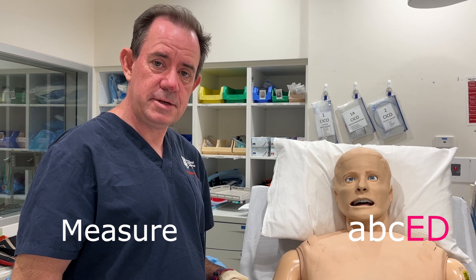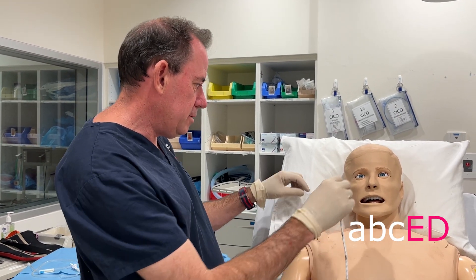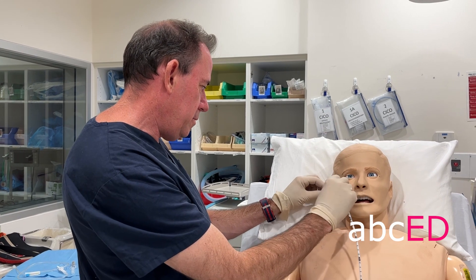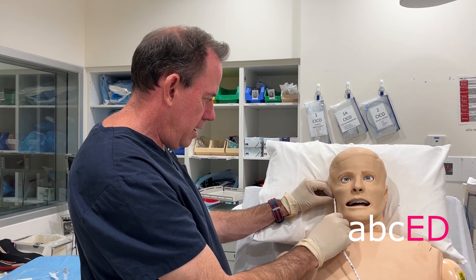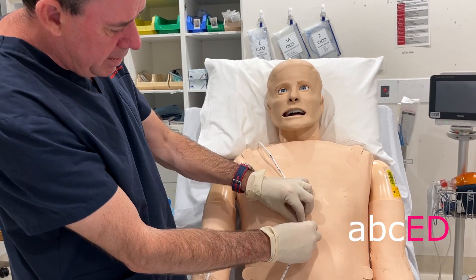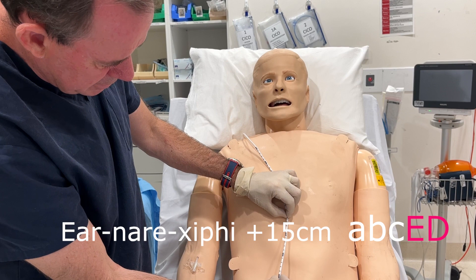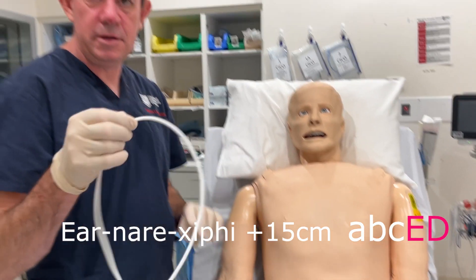What you want to do first is actually measure how far in the nasogastric tube is going to go. The best way is to measure from the earlobe to the nare, and then all the way down to the xiphisternum, and add 15 centimetres. In this person, 55 centimetres is going to be my insertion mark.